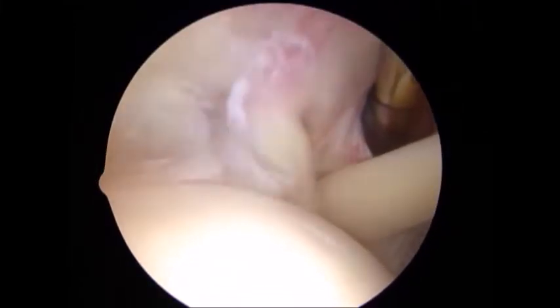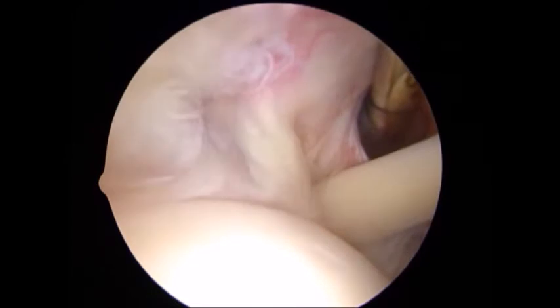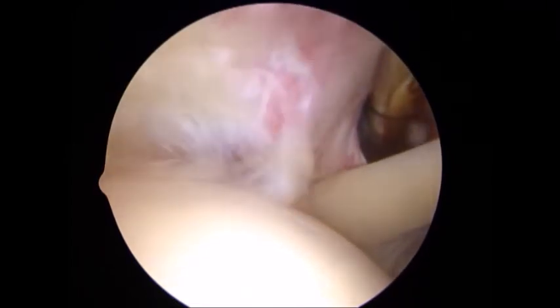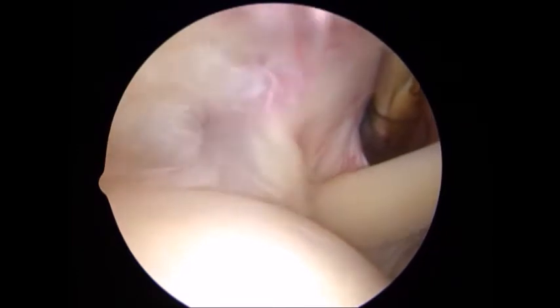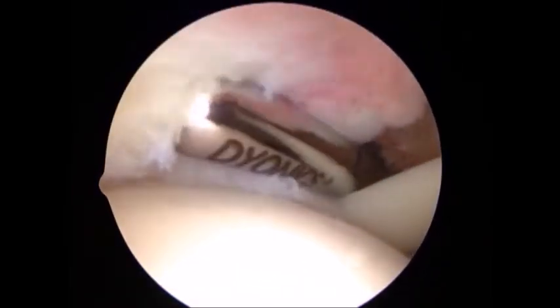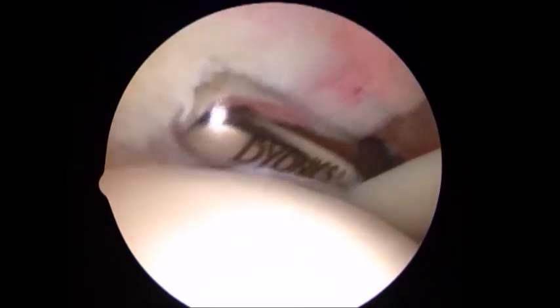In this third example, again in a left shoulder in the beach chair position, we can see a more obvious case of the bellows sign. Debridement of this area of superior capsule again exposes a larger rotator cuff tendon tear.